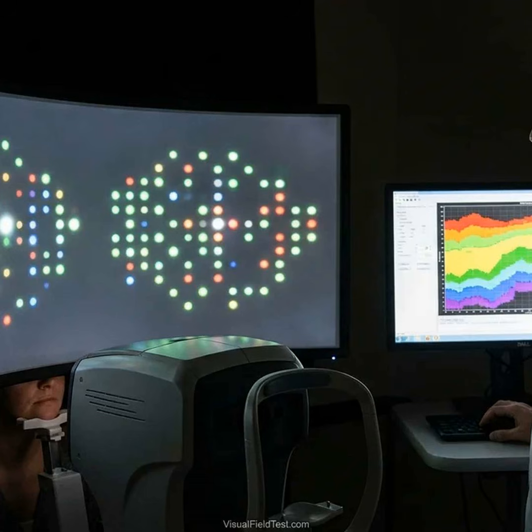Temporal flicker contrast perimetry. Temporal contrast sensitivity, the ability to detect rapid flicker or motion, is largely carried by the magnocellular M-cell pathway. Tests that measure flicker perception, flicker perimetry, or that exploit the frequency doubling illusion both stress these fast pathways. In flicker perimetry, patients detect light-dark alternations at various frequencies and contrasts. In frequency doubling technology, FDT perimetry, a grating flickers at a high rate, e.g. 25 Hz, creating an illusion of doubled spatial frequency. This preferentially stimulates the parasol M ganglion cells in the retina.